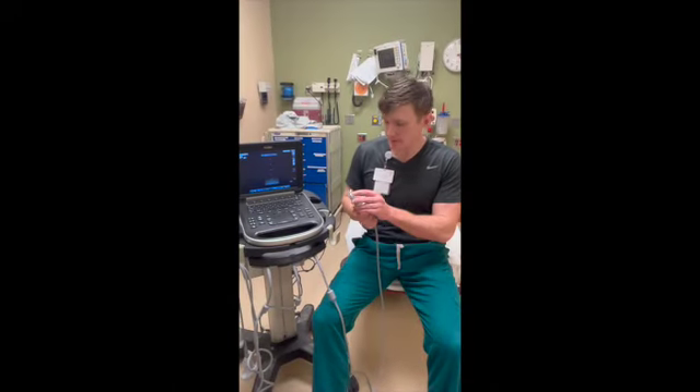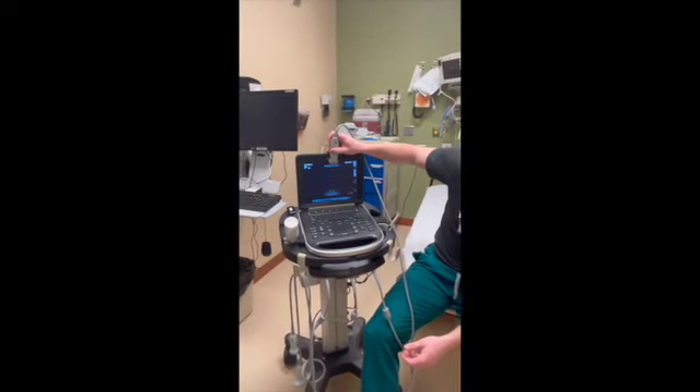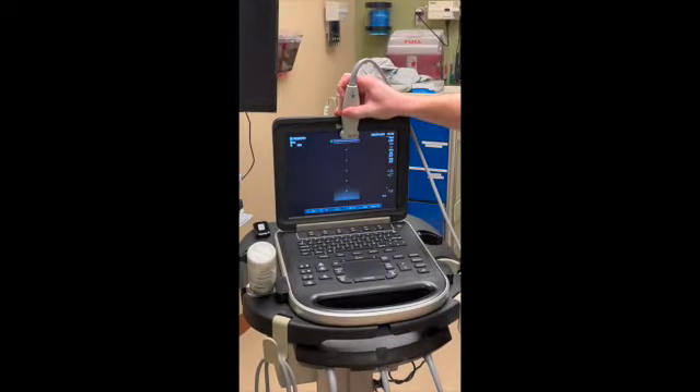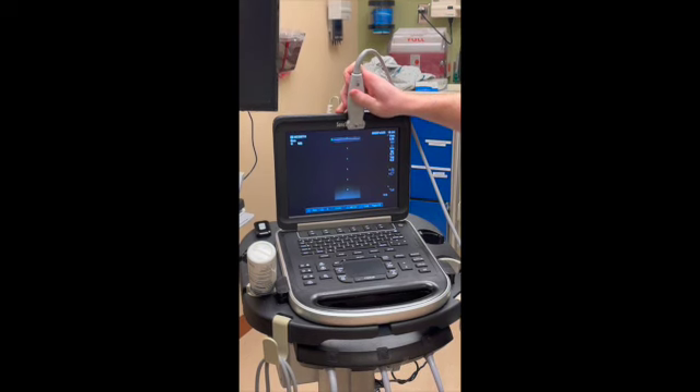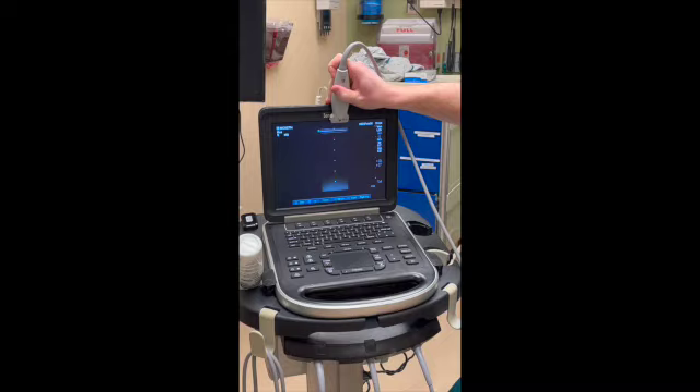On the probe is an arrow, and that arrow is an indicator that aligns with the dots on the screen. If you place the probe on the skin and it lines up with the dots, then that is your correct orientation.